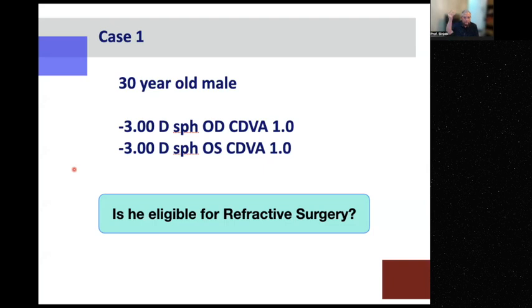And the very old ones that we were using maybe 20 years ago, and they are still here, they induce plus spherical aberration, about plus 0.15 microns, which are very helpful if the patient has high minus spherical aberration in the cornea, and we want to compensate it to bring it down to make the vision sharper. All right? So that's it.